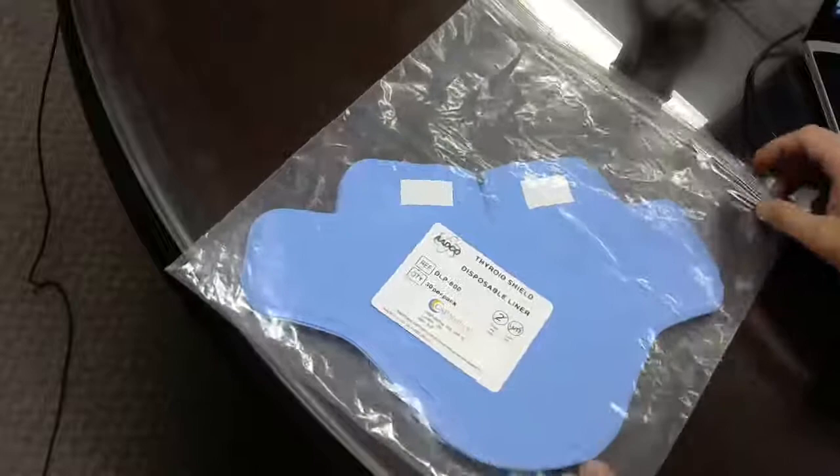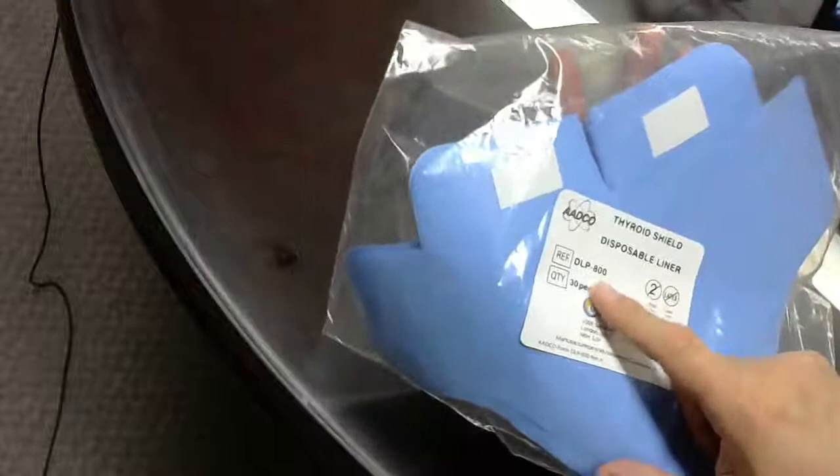Hi, Steve here from CSP Medical. This is a quick video showing you the AADCO Thyroid Shield Disposable Liner, which is model DLP 800.